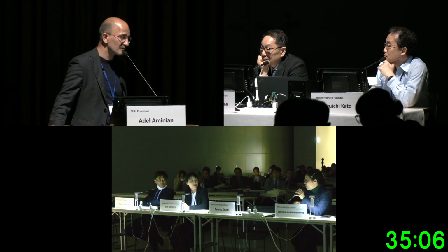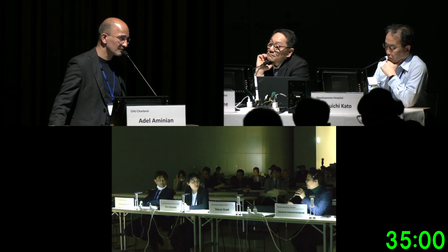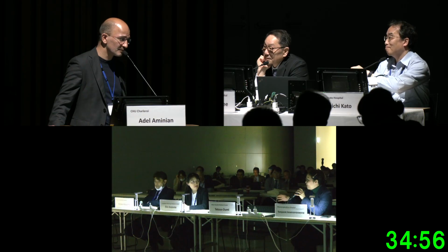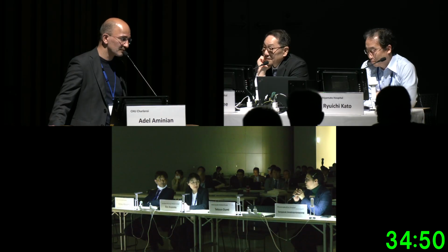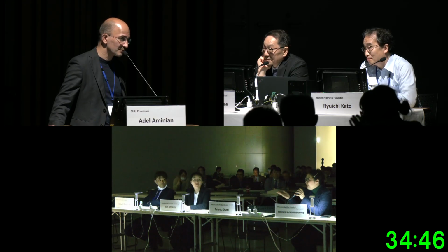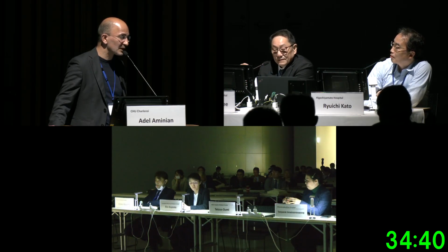So from my experience, I do three things. The first is the bony marker, as Dr. Lee recommended. The second is the angiographic view, and then I use the ultrasound. Don't go too high and don't go too low. That will help us for about the first 50 cases when starting. That's a good point.